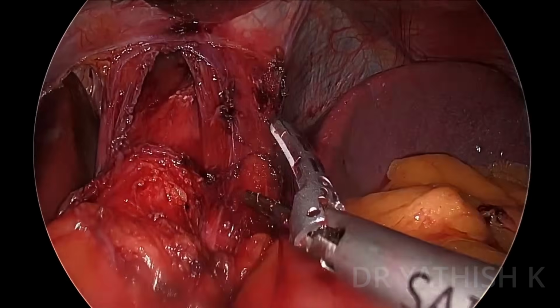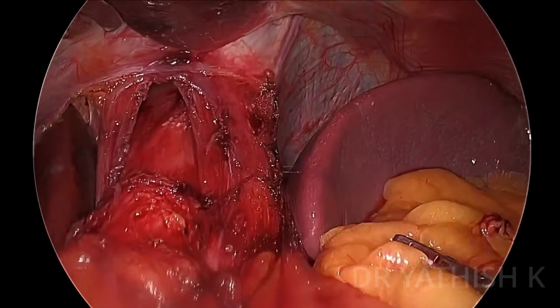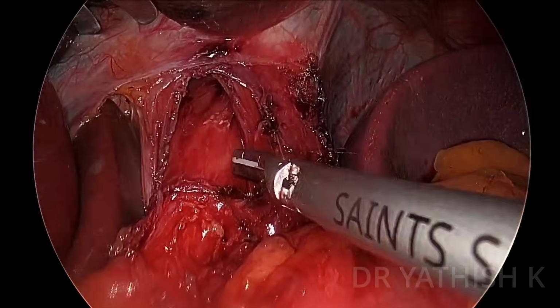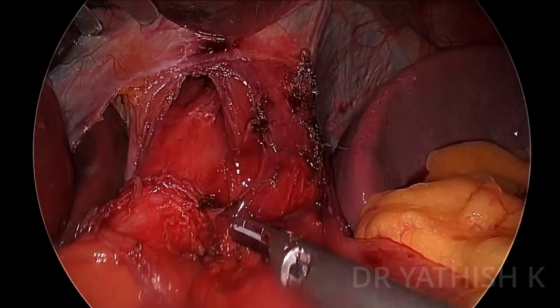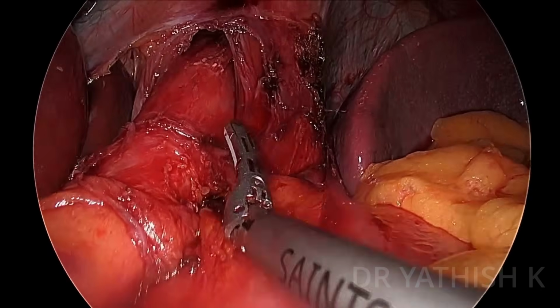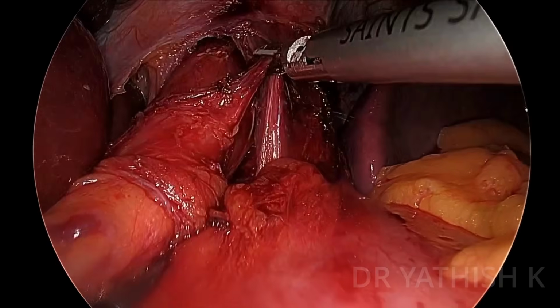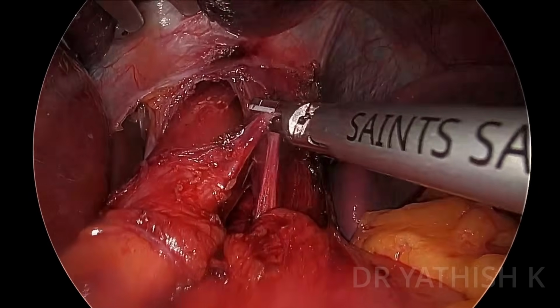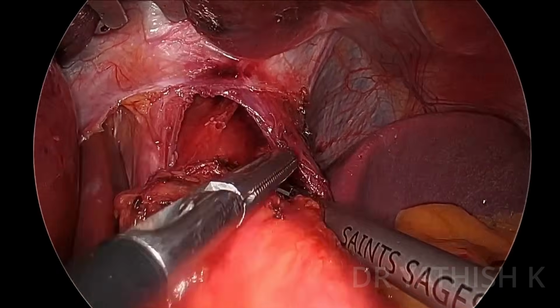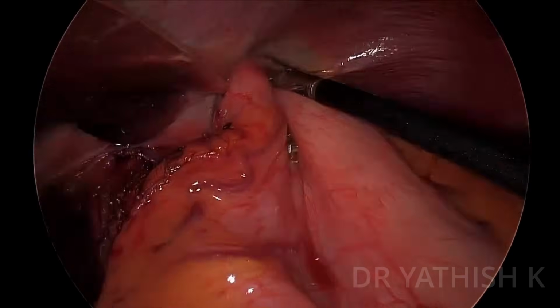There are various reasons for that. One, your successful surgery depends on a well mobilized esophagus. Number two, there are minor blood vessels running on either side of the esophagus to the thoracic part. So we have to be careful, and minimal dissection should be done.